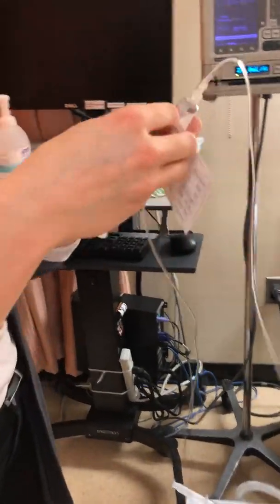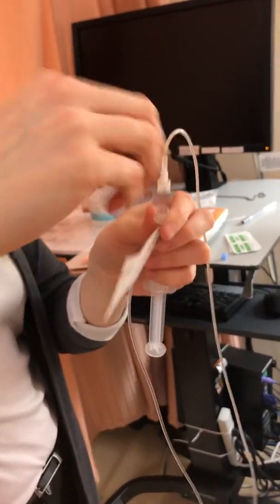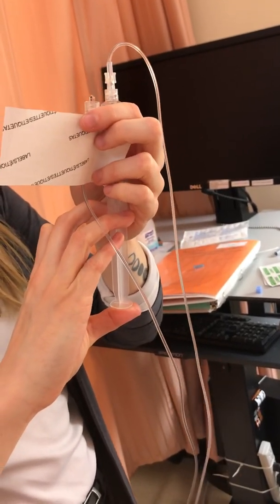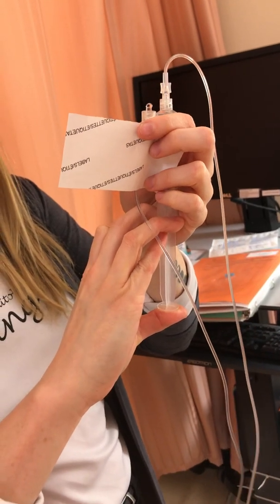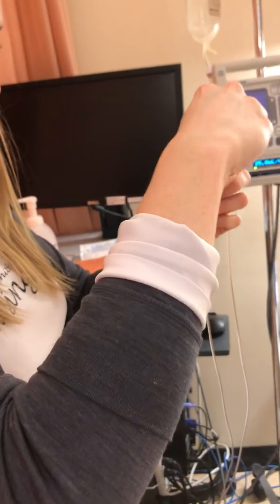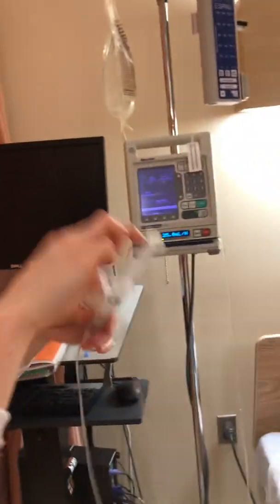Okay, I'm going to prime my line with pushing a little bit of the drug up to ensure that it is primed. Okay, it is primed. So this has remained sterile. I haven't touched the tip of it. Okay, so my line is primed.